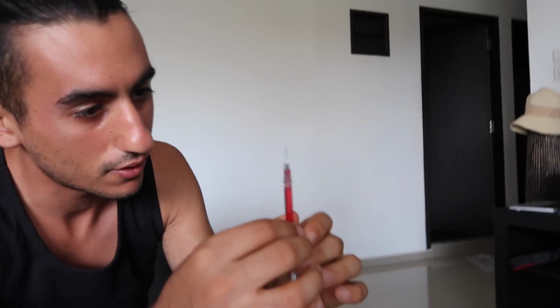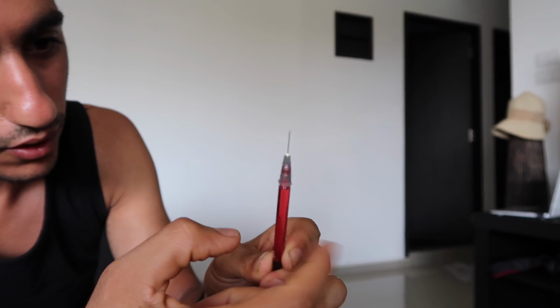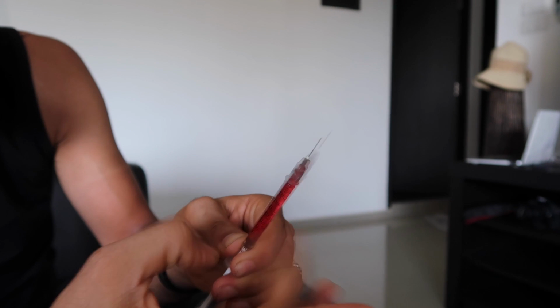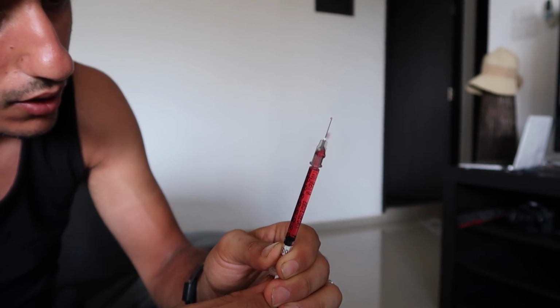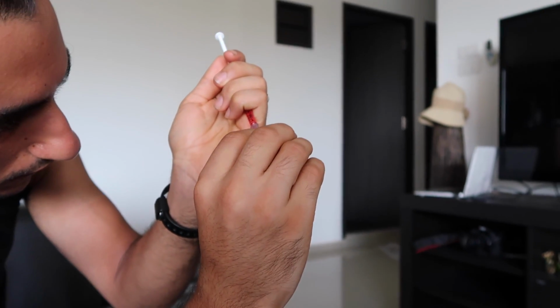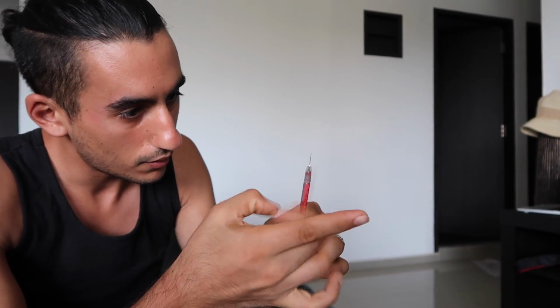I'm trying to get a bit more out. So you want to tap it to remove all the air bubbles, just to move the air bubbles all the way to the top. As you can see, there's a few air bubbles here. You don't want to inject yourself with any air, so that is bad. So what you want to do is just tap it, give it nice little flicks, and move that all the way to the top. Sometimes it'll drip some out, don't worry. But at least now we know we've got all of it out. Then we'll see if there's any bit left. There's a tiny little bit left over, so we'll see if we can get that. Well, that's about what we can get. So that's that done. Again, remove all the air as much as you can. Okay, flicking it.